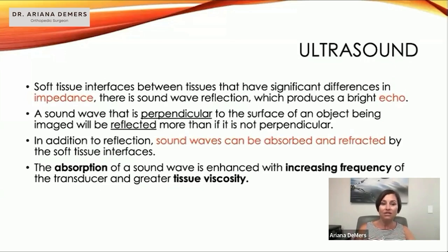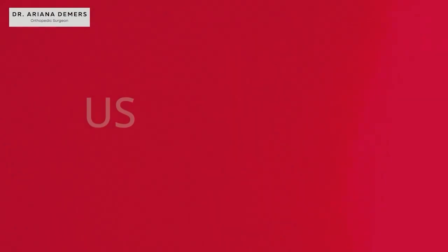So additionally, sound waves can be absorbed depending on the density, or refracted, meaning that it bounces off at an odd angle. So absorption of the sound wave is enhanced with increasing the frequency of the transducer, as well as the tissue viscosity will help increase the absorption of the sound wave.